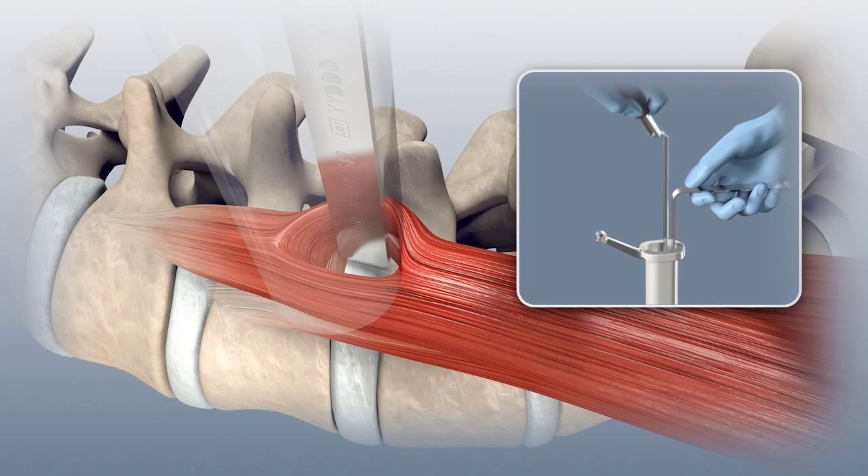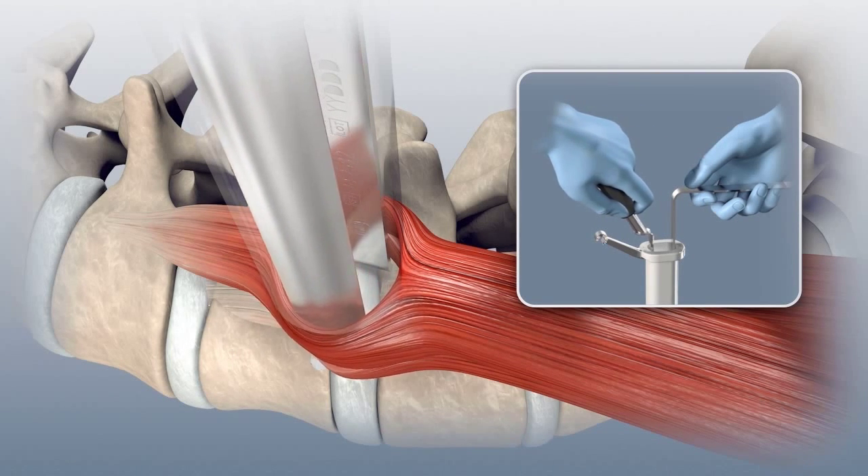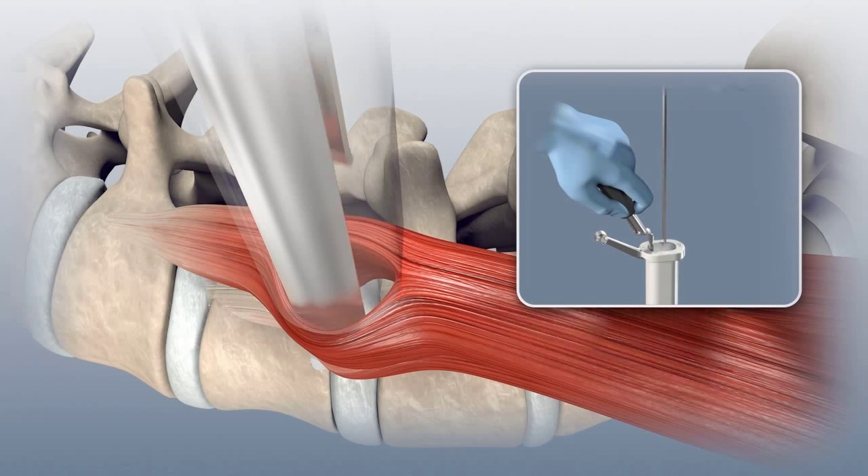Insert the first psoas retractor through the split and retract the psoas muscle anteriorly. As the muscle is retracted, maintain contact with the annulus and the vertebral body. Maintain gentle downward pressure on the psoas retractor and remove the 90-degree nerve retractor.